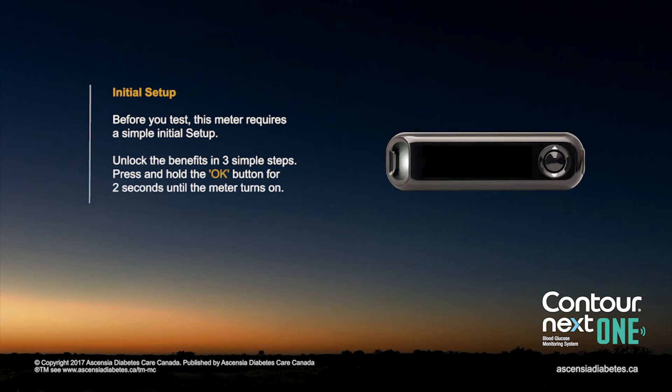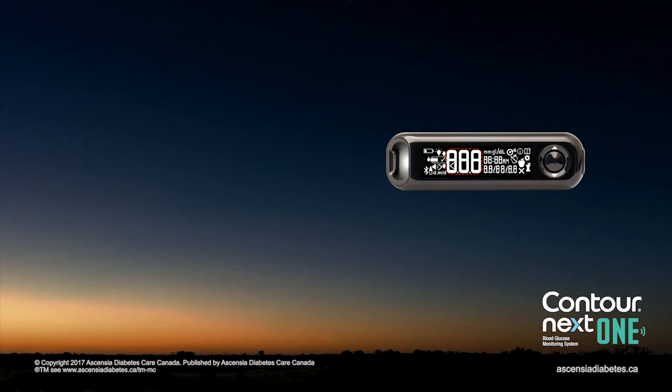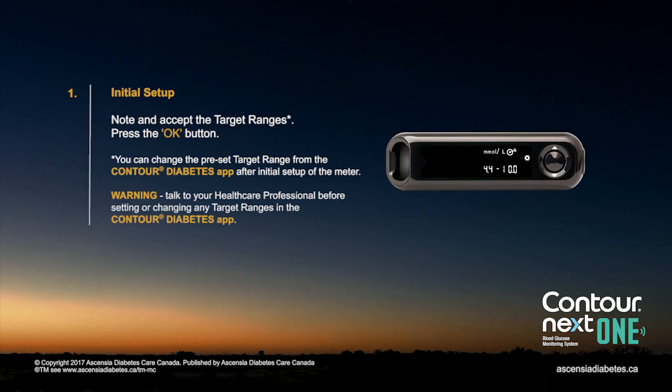Unlock the benefits in three simple steps. Press and hold the OK button for two seconds until the meter turns on. Make note and accept the target ranges, then press the OK button.